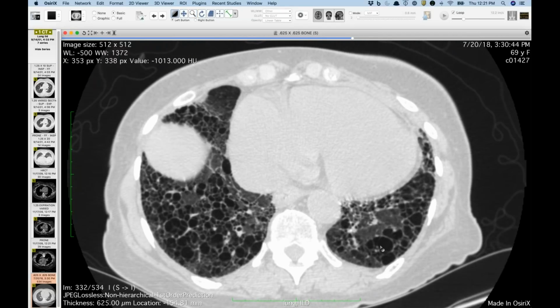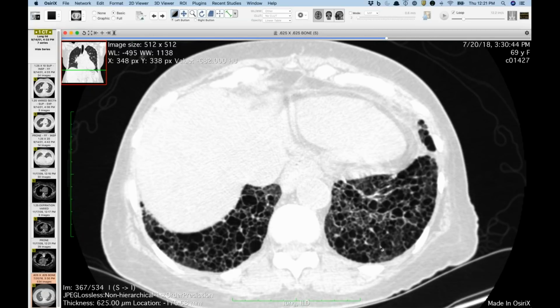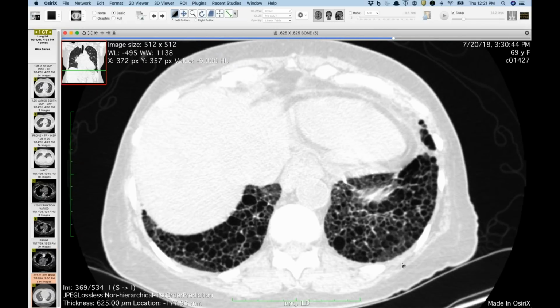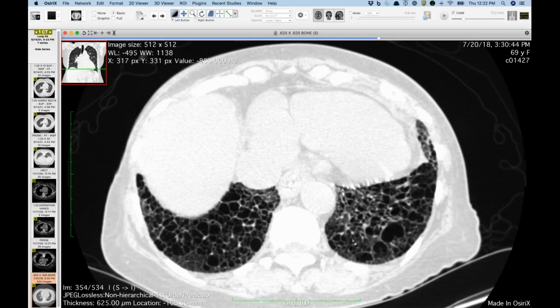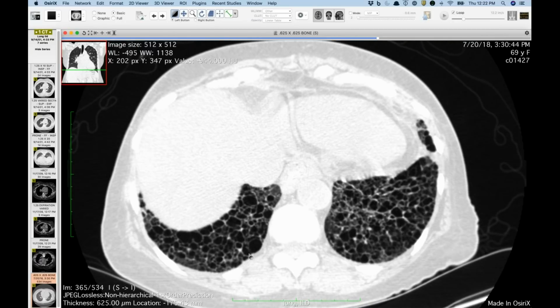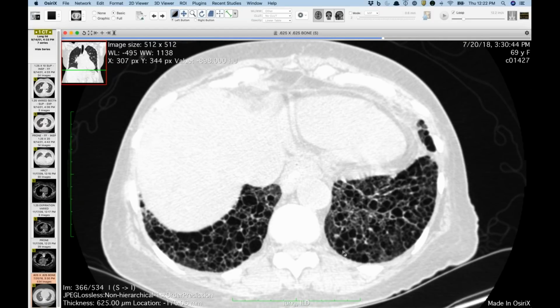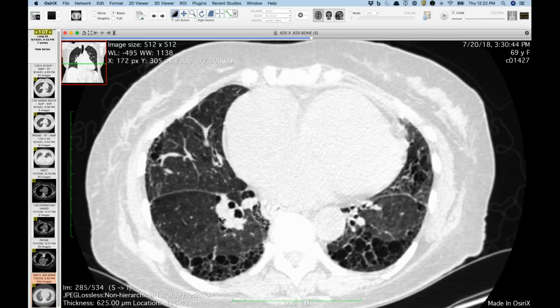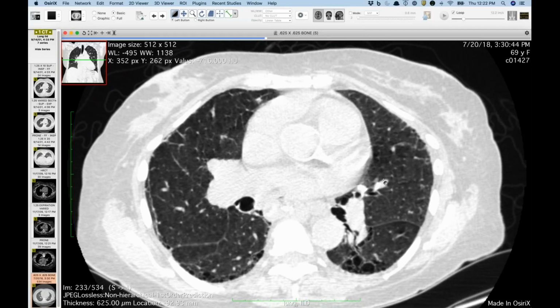At first glance, you might want to say that this is just severe honeycombing in the lower lobes, except there are a few things that are abnormal. Number one, there are some areas of relative subpleural sparing in both lower lobes. Number two, there's really no traction bronchiectasis. Of course, you don't have to have traction for a diagnosis of UIP, but you can see these airways going all the way out. Sure, maybe they get a little dilated in some areas, but in other areas they're completely normal caliber in the lower lobes. And third, a lot of these cysts are peribronchovascular rather than purely subpleural.